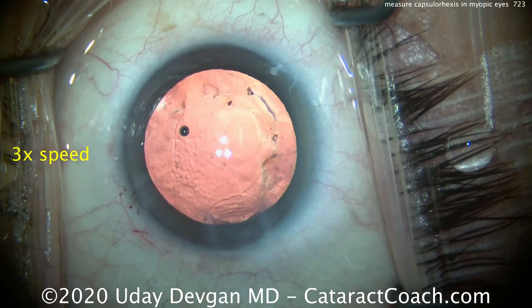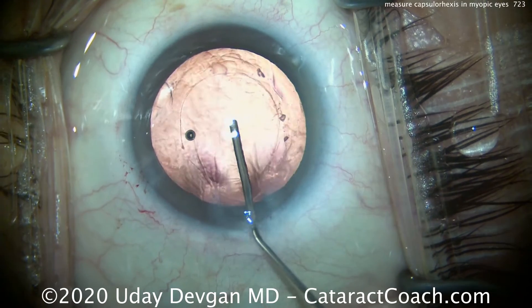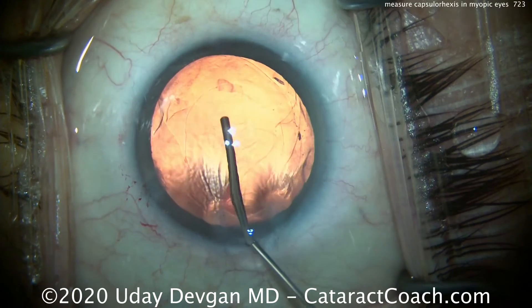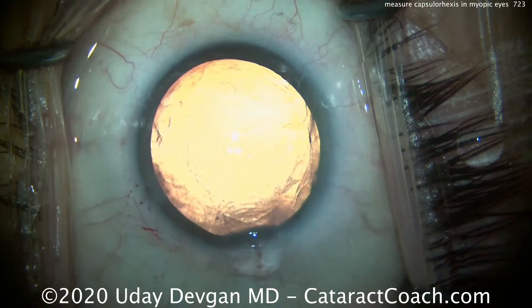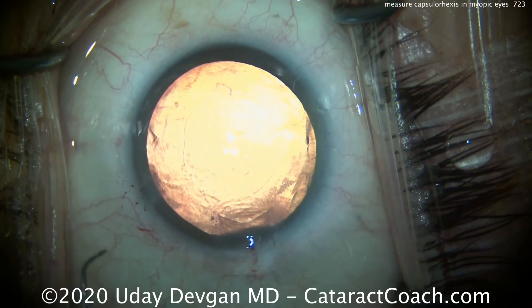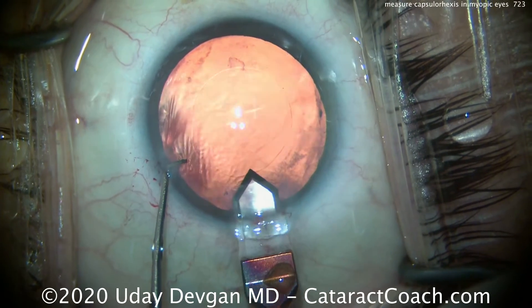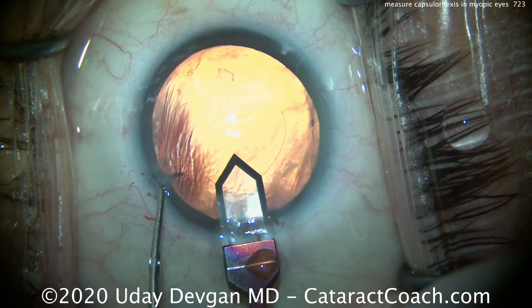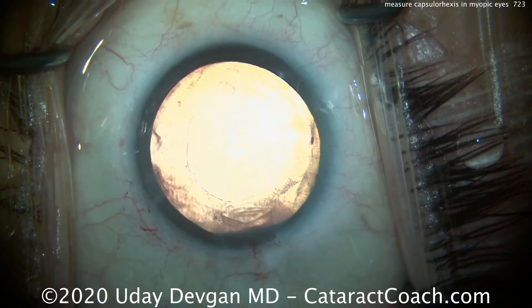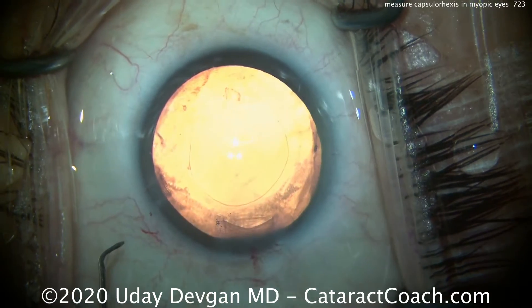You're much better off aiming for a slight or even mild degree of myopia. Here we're filling the capsular bag with viscoelastic to expand it, and you can see there's a really nice round capsulorhexis. We're going to put the lens in the eye, but first we need to slightly enlarge the incision. We'll use the diamond keratome one more time to slightly open the incision. This patient also happens to have astigmatism at that meridian against the rule, and that incision is actually going to help the patient.